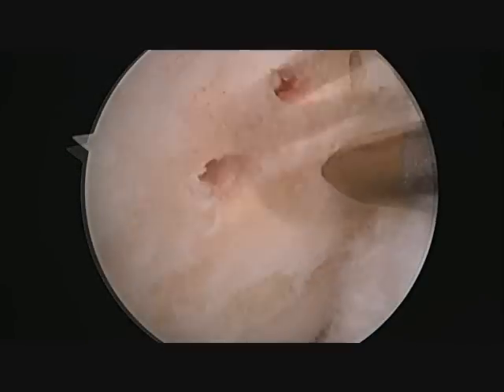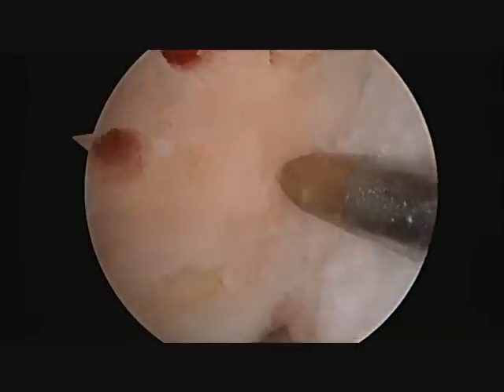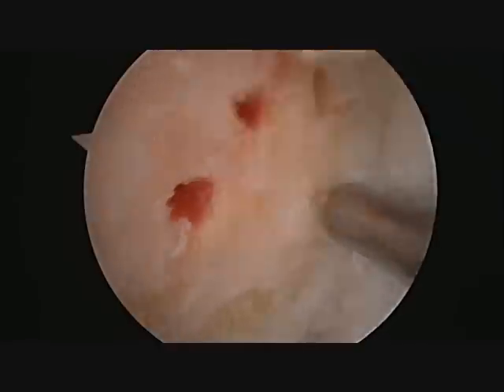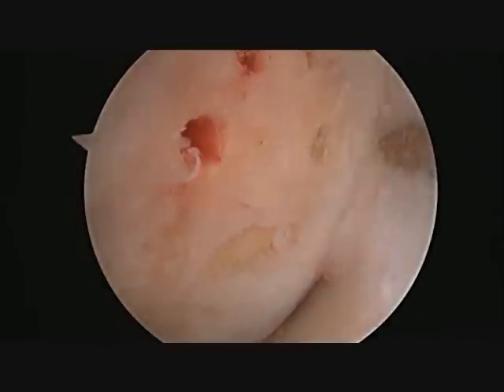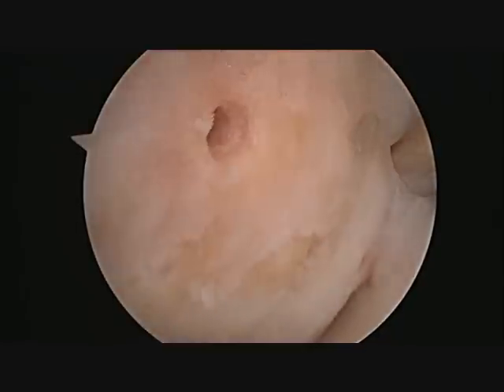Once that is completed, the microfracture awls are inserted and hammered through the subchondral bone into position. This will bring a large amount of blood and cellular products from the bone marrow into the defect to hopefully encourage healing with new scar cartilage. Some of these blood products can already be seen oozing into the defect through the microfractured holes.